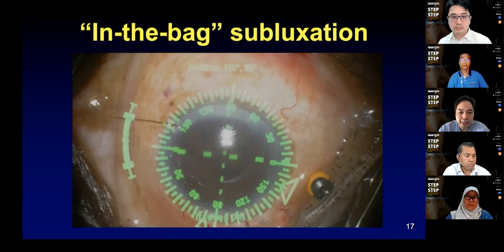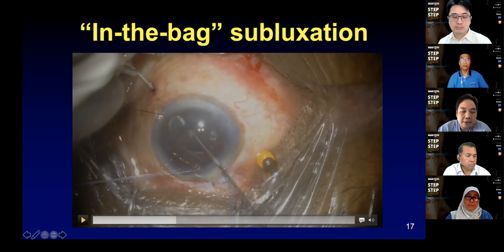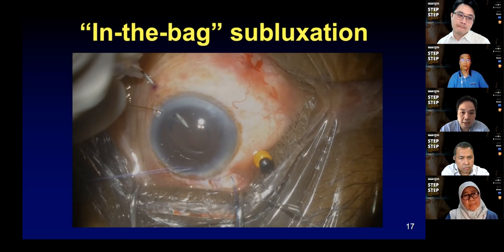Let's pause a little while. The first suture here is about 2.5 millimeters posterior to the limbus. What I'm doing is passing this 27 gauge needle. As you saw earlier, I used the Kuglen hook to identify where the haptic is so that I can puncture the capsular bag under the haptic and come through this way, creating the first pass under the haptic itself.